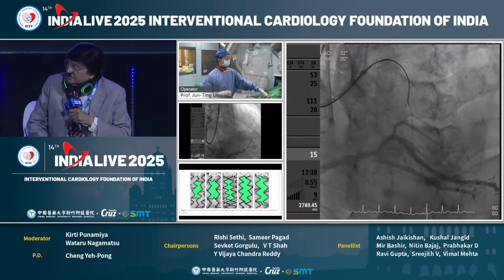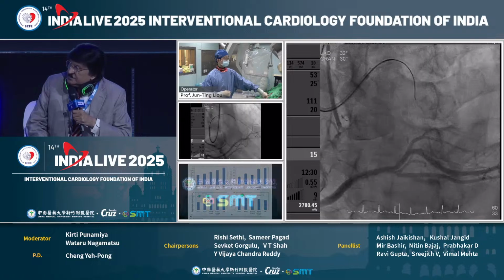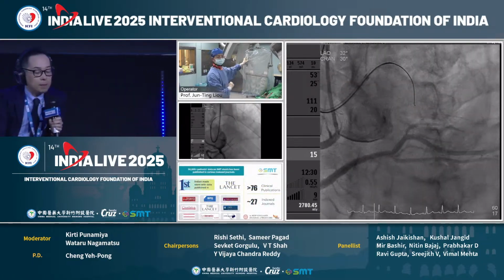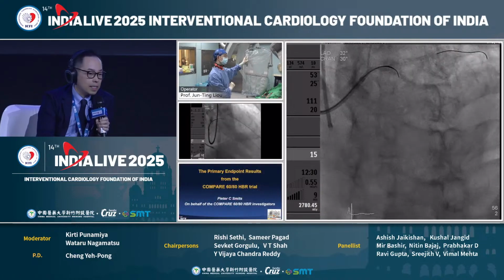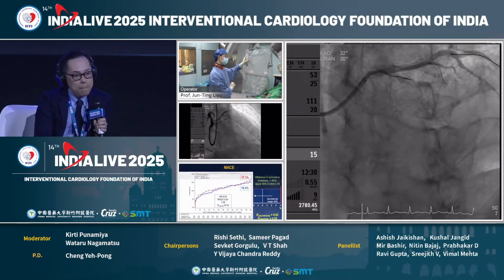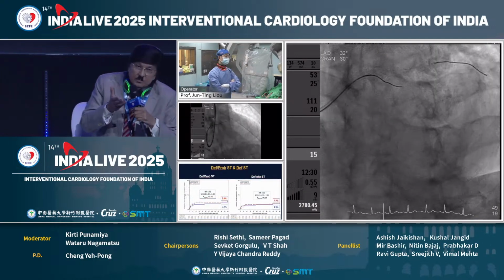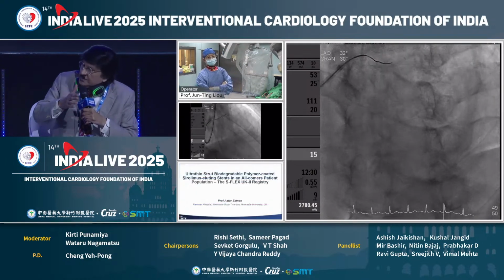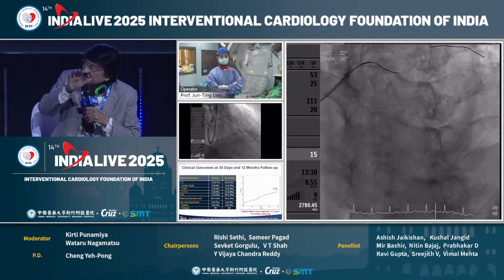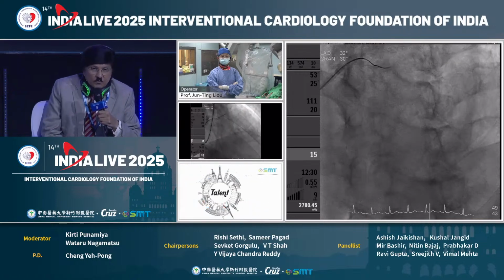It looks like a real struggle, and when you use the Gaia Next, this is the time to switch to another manner like retrograde. Yeah, because I see at least this wire has gone to three places. Maybe there is a hematoma by this time. Once it went laterally, another time medially, then superiorly. So, Professor Liu, what's your take on that?